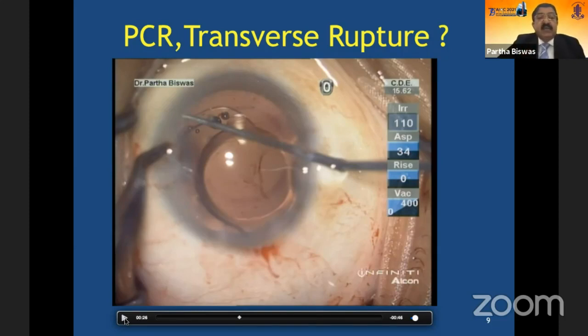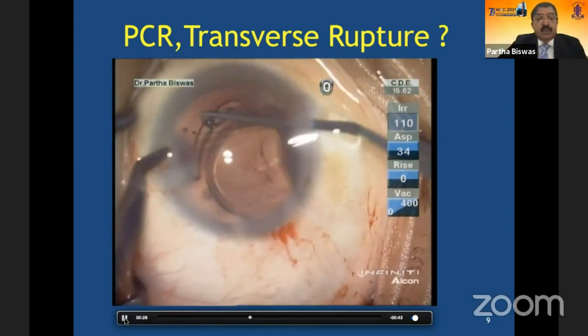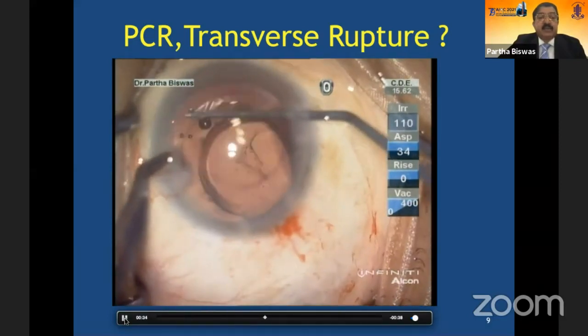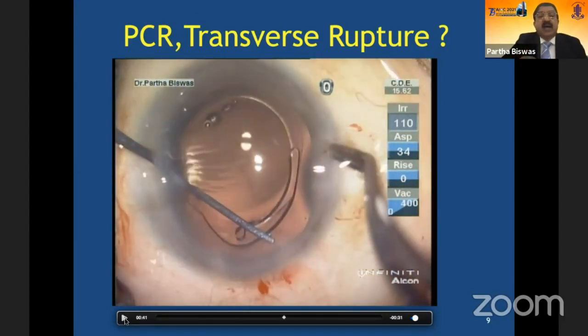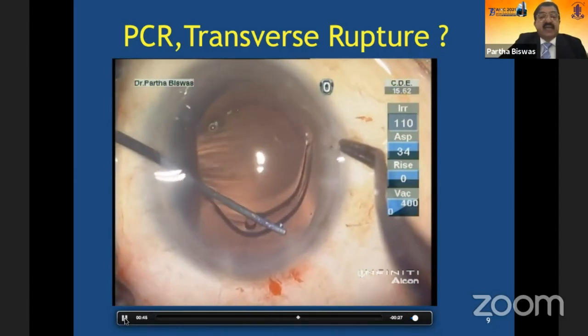Having said that, then what I'm doing is I'm placing this intraocular lens and then tweezing it inside the bag here, like that. Okay, so once I tweeze it in, it goes into the bag. So once this has gone into the bag, the next part is making a kink once again of the trailing haptic as well. And this positioning is very important. Please mark this position. It has to fold upon itself like an elbow and then be placed into the bag, and that has to be under direct visualization.